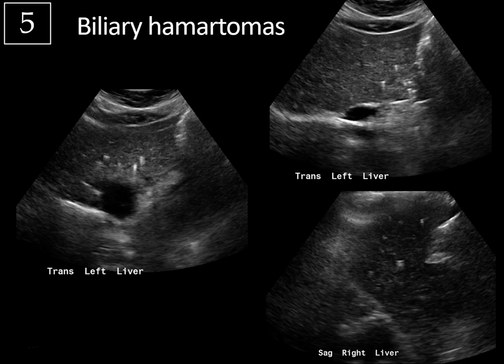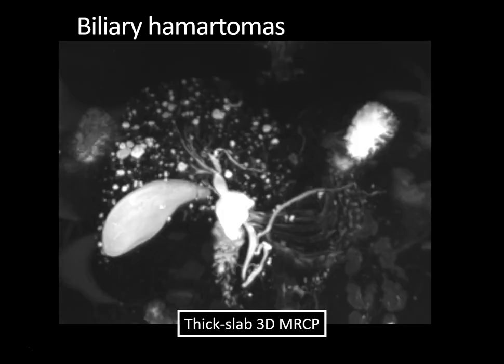These are also known as von Meyenberg complexes. On ultrasound, because the liver is filled with these little cystic areas, it can have a heterogeneous and coarse appearance to the liver echotexture, but this comet-tail appearance is fairly characteristic. An MRI will typically show these lesions with greater detail and number. You can see that the liver is just filled with these tiny little T2-bright cystic areas on this thick-slab 3D MRCP sequence. Here's the gallbladder, as well as the extrahepatic bile duct and pancreatic duct.